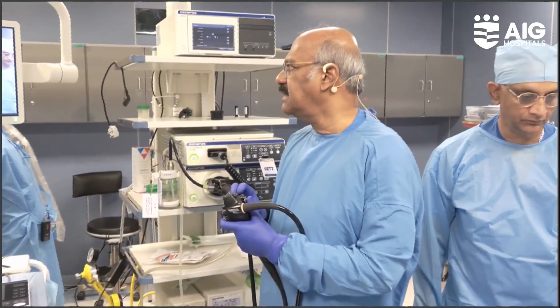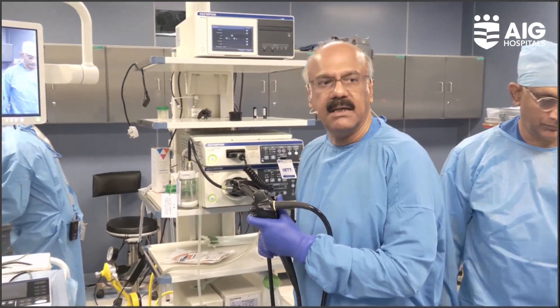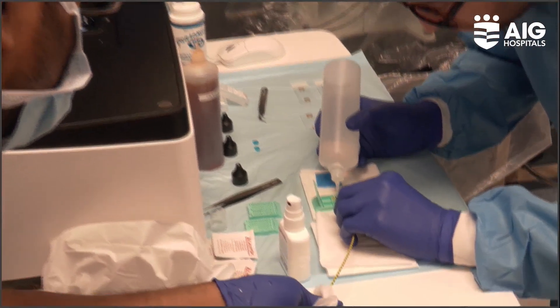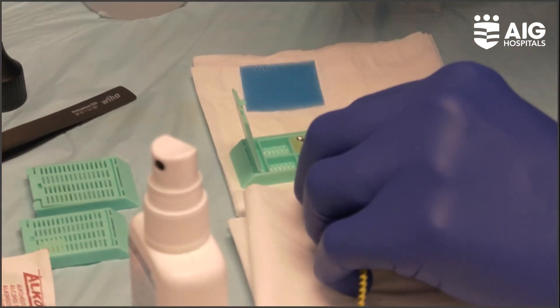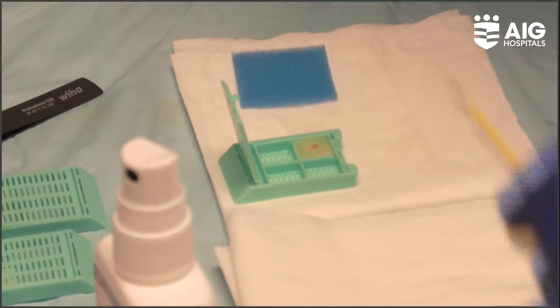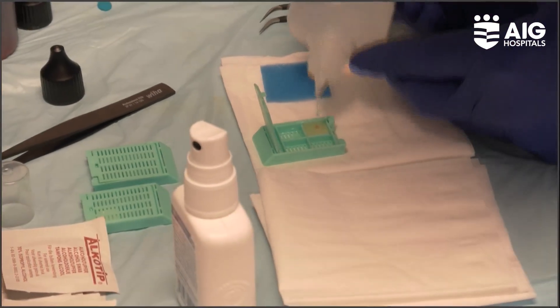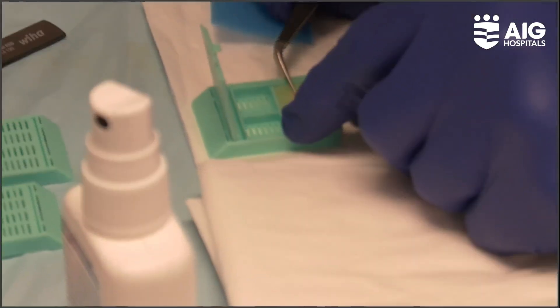You can see the pathology preparation of this — how it's made — so that even before I finish my complete examination, we'll probably have an answer. Dr. Babak is preparing this specimen. He's preparing it a little differently from what we do in conventional histopathology. We'll ask Dr. Babak and Dr. Anuradha to tell us what they're actually doing.